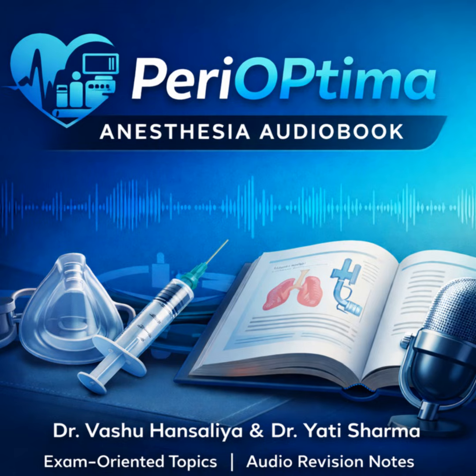And that intellectual leap is everything. It is. The understanding that you have to guarantee adequate oxygen, not just assume it's there, led him to design some of the very first apparatus to deliver oxygen and nitrous oxide in variable proportions. So that historical need is the direct ancestor of every modern hypoxic guard we're about to talk about. It is the direct philosophical origin, yes.